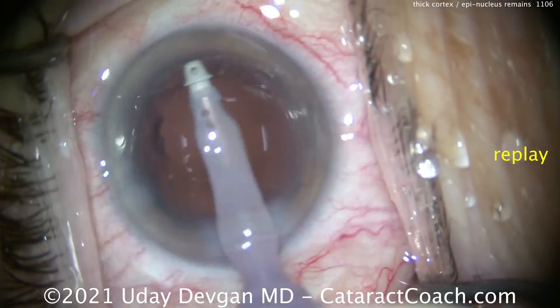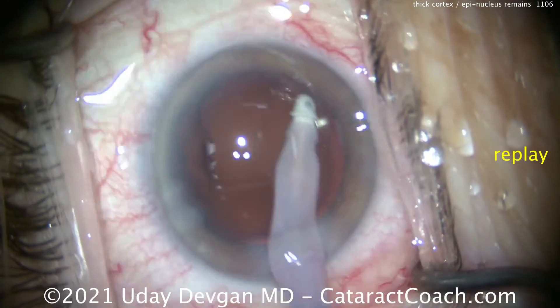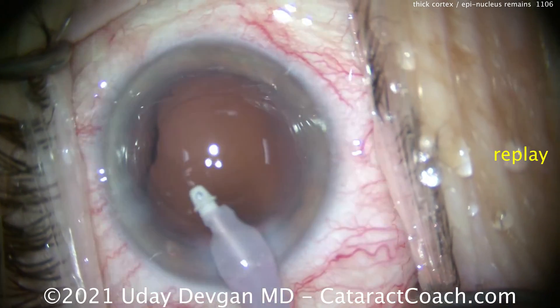And once that's complete, it looks pretty good. There you see we're cleaning up the undersurface of the posterior capsule or the anterior capsule rim. Everything looks really clean here. This patient is going to do fine.